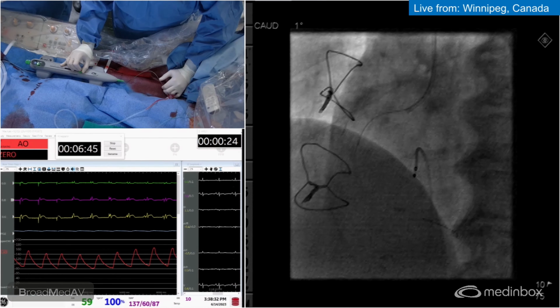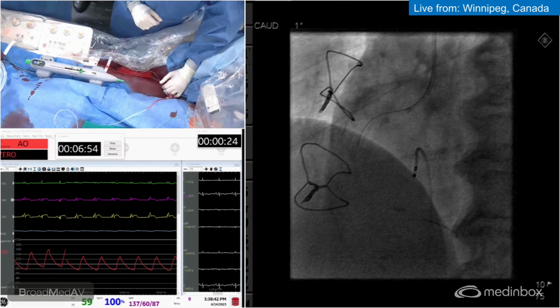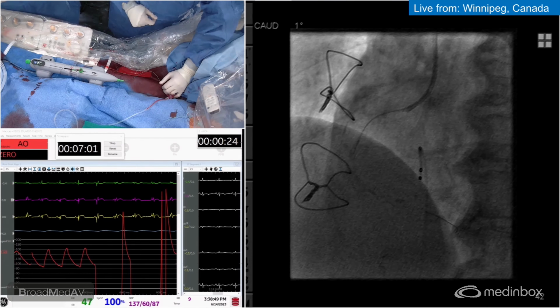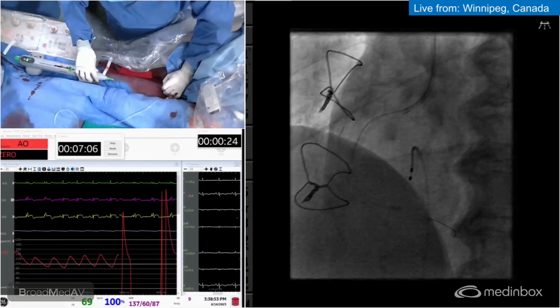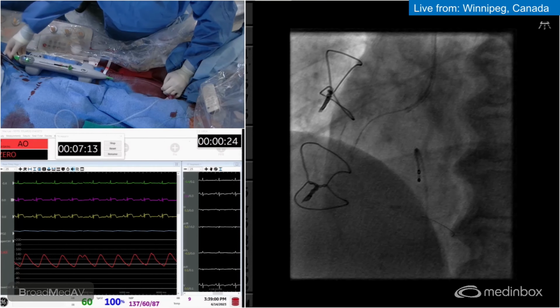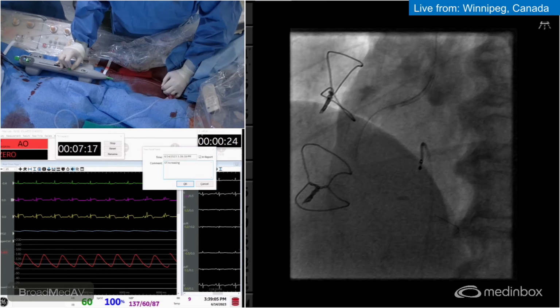So now you're in the segment where the balloon ruptured. That's right in the mid segment. I think it was the tightest spot. That's where we were having difficulty last time getting our catheters across. Perfect. Good. I think once you make it through the mid segment, which we're kind of running out of burst space here, so my wire space here. So we'll keep on going. Yeah, I think you're right at it.